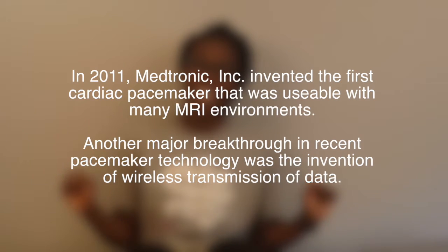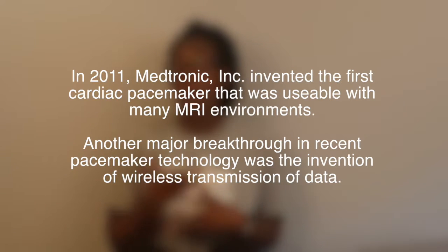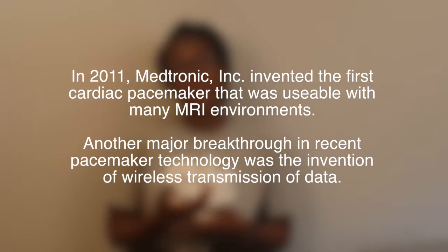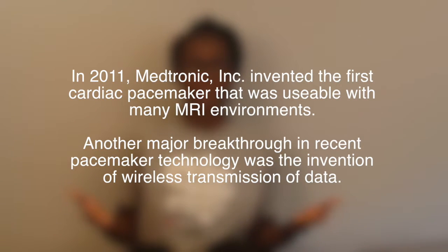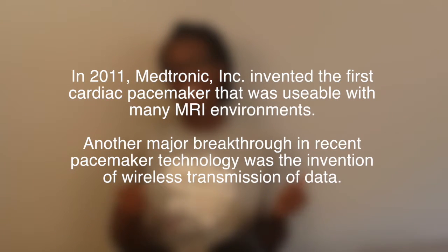But recently, pacemaker patients experience a major effect from electromagnetic interference. And this company called Medtronic invented the first cardiac pacemaker that was usable in many MRI environments. And as you know, MRI is a critical diagnostic tool in today's clinical environment.